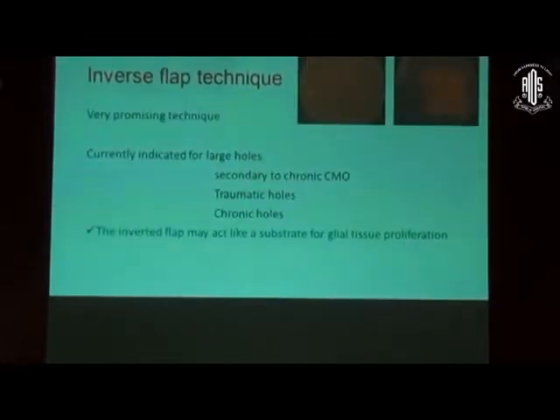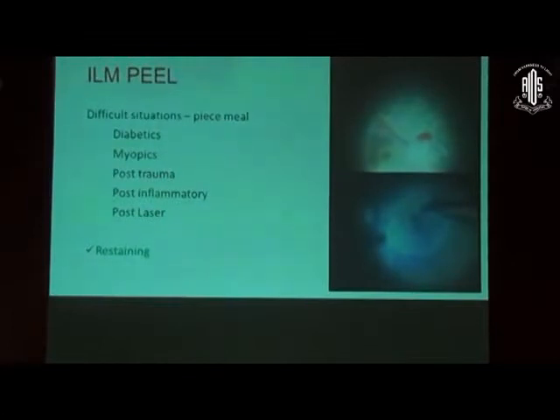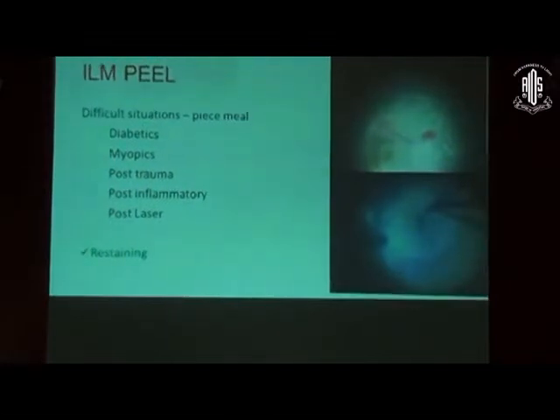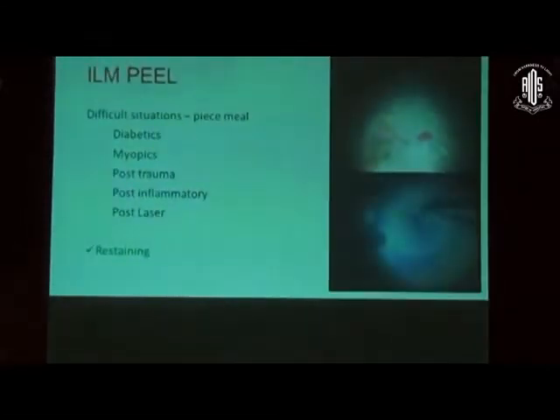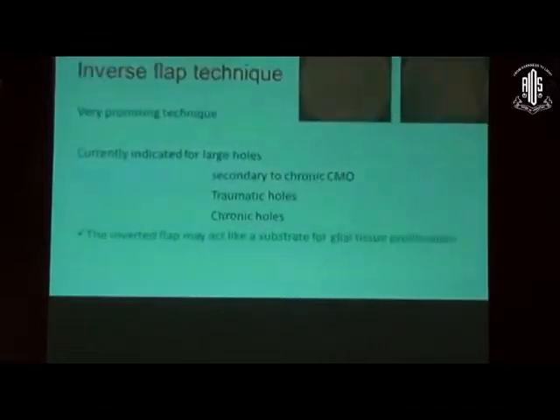post-macular laser cases. And the other thing is, after once you have finished this peeling, see the second bottom one looks relatively a decent peel. There is enough whitening around the hole. So this video shows enough of peel, but once you again put the dye, you can see the tags of ILM still adherent to the edges of the hole. So again, what I would suggest is to do a restaining after the peel so that you ensure that the ILM has been peeled well enough all around the hole.